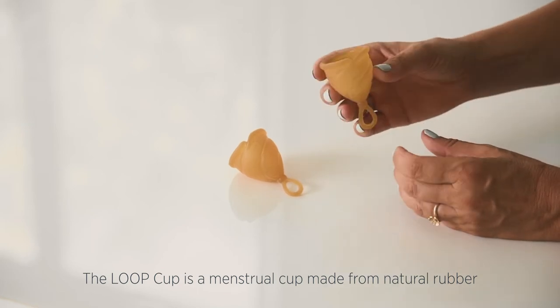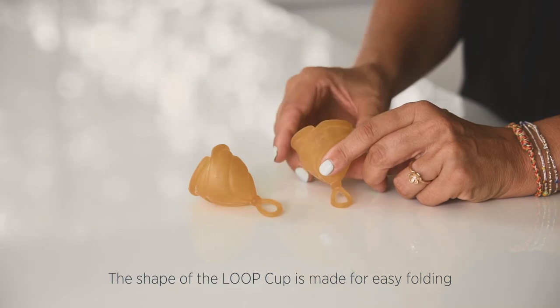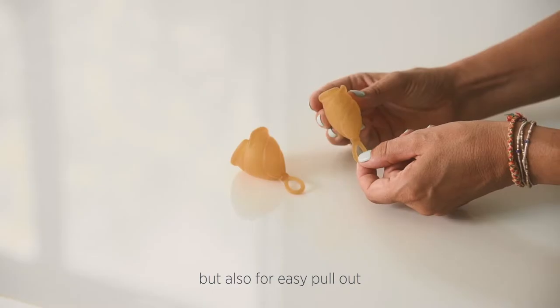The Loop Cup is a menstrual cup, which is made from natural rubber. The shape of the Loop Cup is made for easy folding, but also for easy pullout.